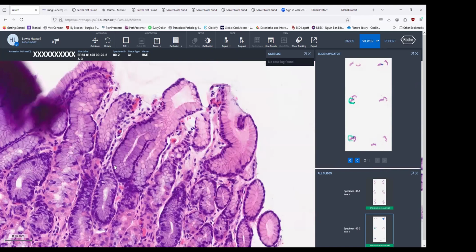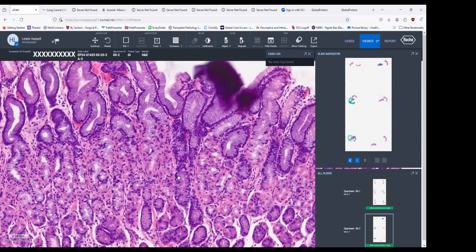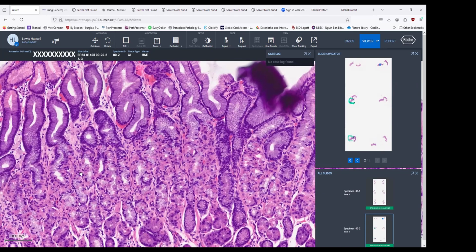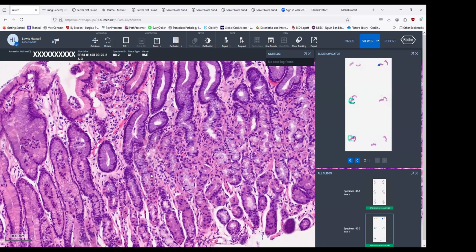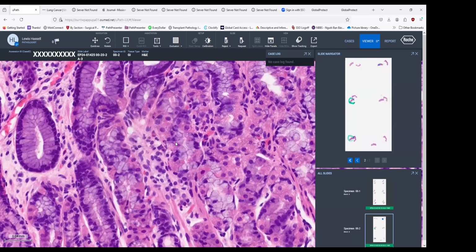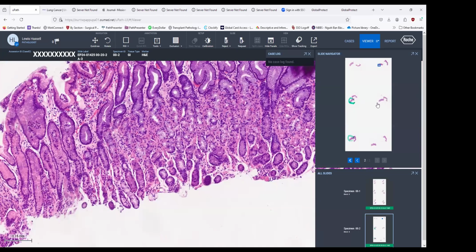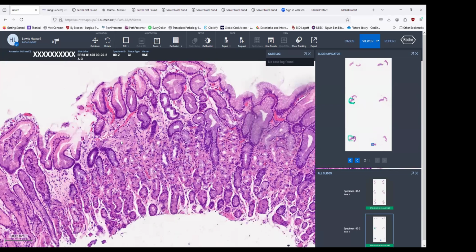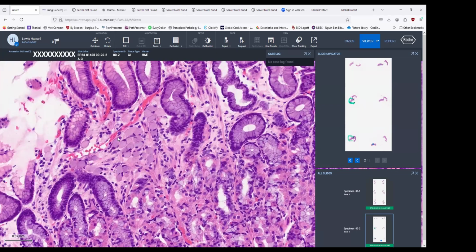With signet ring neoplasia, we don't usually see a surface lesion, and we may not see an in situ lesion, but we can occasionally see an in situ type of lesion as a precursor in some settings. And we've done a video on that topic before. Here in our third level, again, we see these cells, but they're very, very few. Maybe there's only 20 cells here.